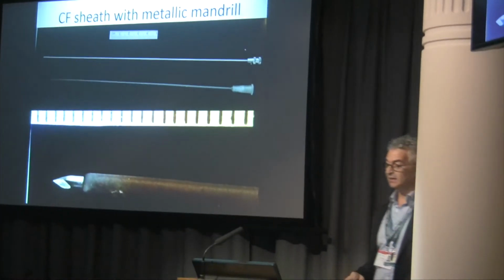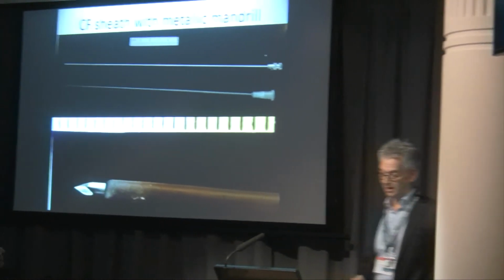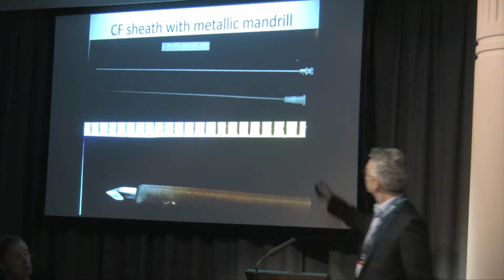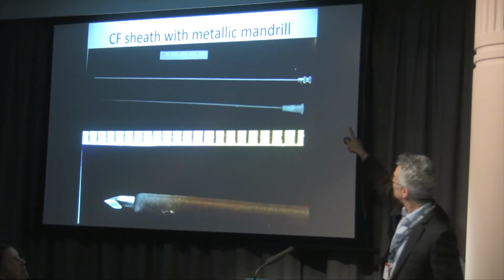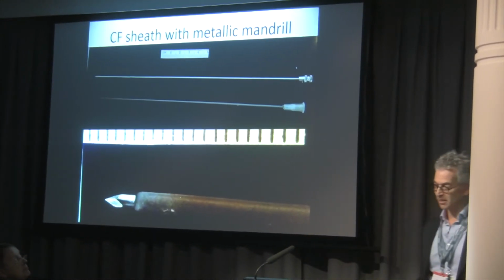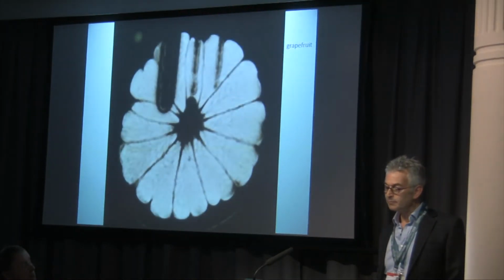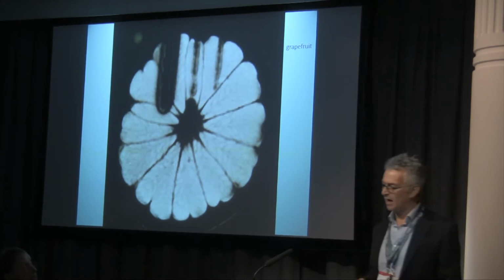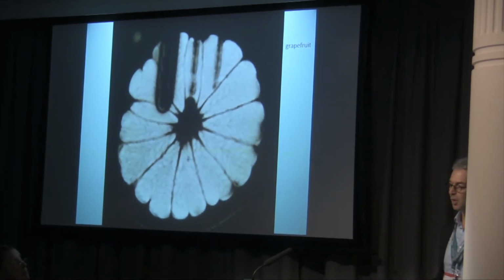Let's see what it looks like. These are the needles. They look rather attractive in their dark grey matte finish, the Luer lock glued onto the end, and the mandrel borrowed from another needle. Now we tried them out. Usually you do it on farmyard animals, but we hadn't got that far. So we used the fruit bowl instead.